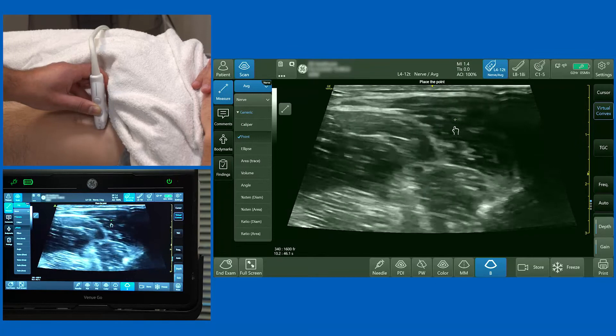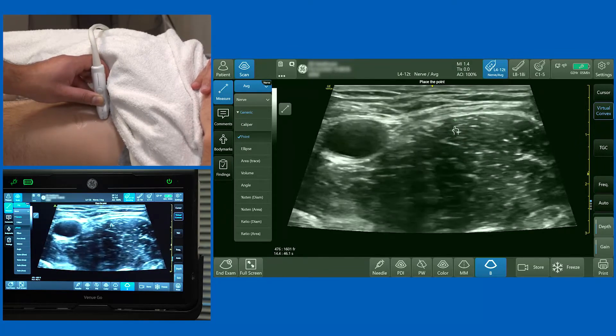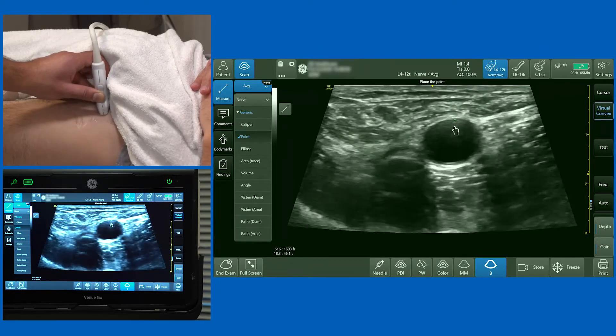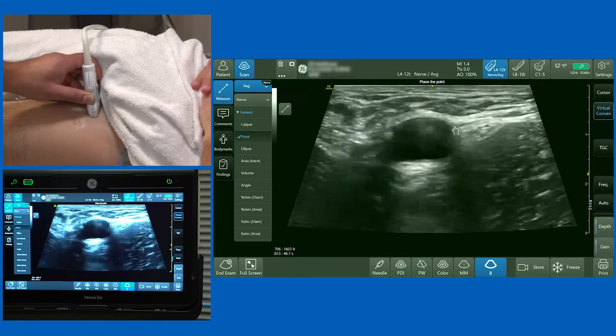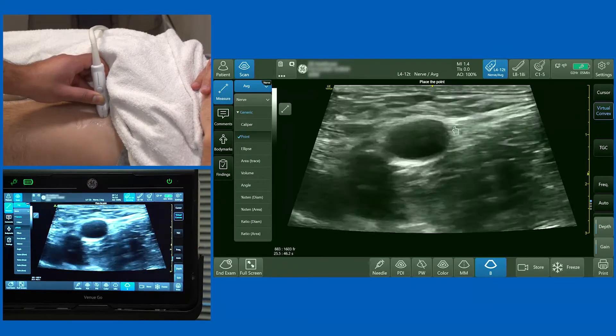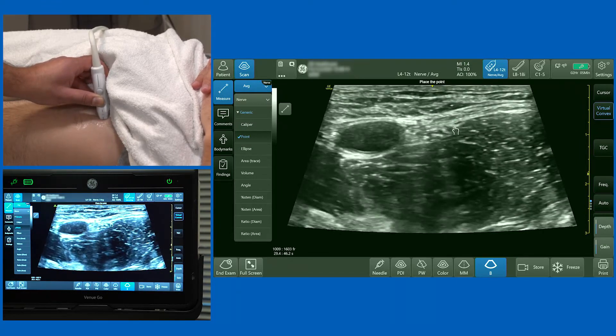Even with color Doppler on, you can clearly identify the femoral nerve. To recap: sartorius muscle, the iliopsoas muscle with fascia iliaca above it, and the femoral nerve right underneath. The femoral artery is medial. Don't perform the block where there are two femoral arteries — you're too low. Ensure you have a single pulsatile structure, with the femoral nerve lateral to it.